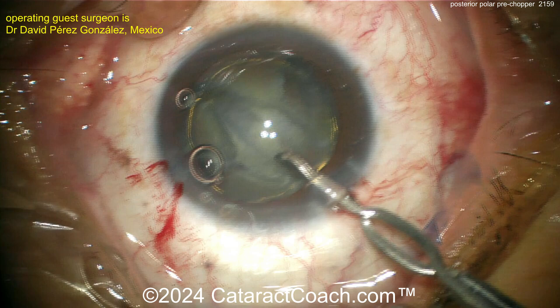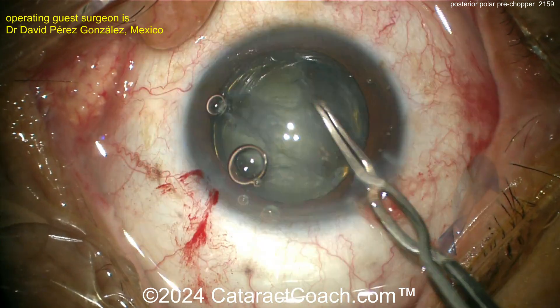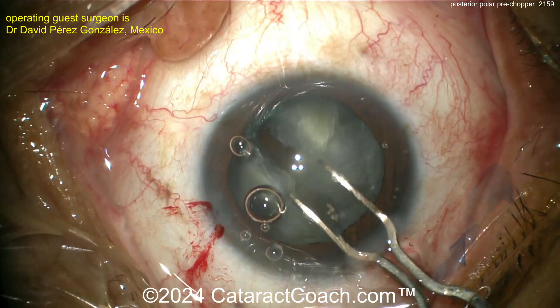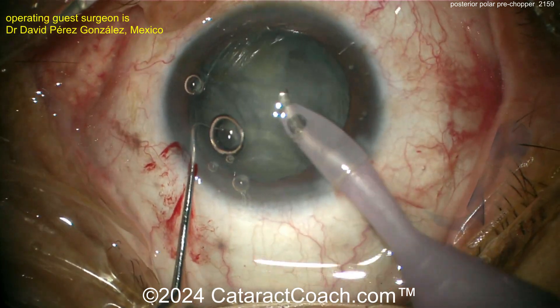Now there's the pre-chopper. You can just split this groove, but be careful — don't put too much pressure. Remember with posterior polar cataract, if you try to stretch out the bag or expand its dimensions too much, you may very well cause a rip in the capsule.